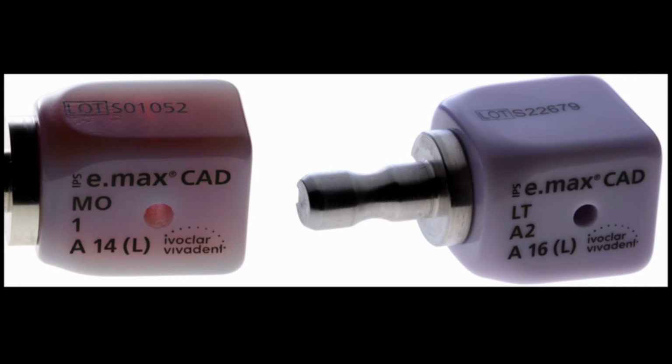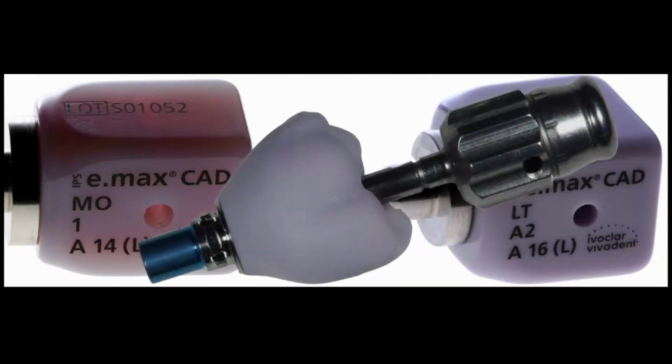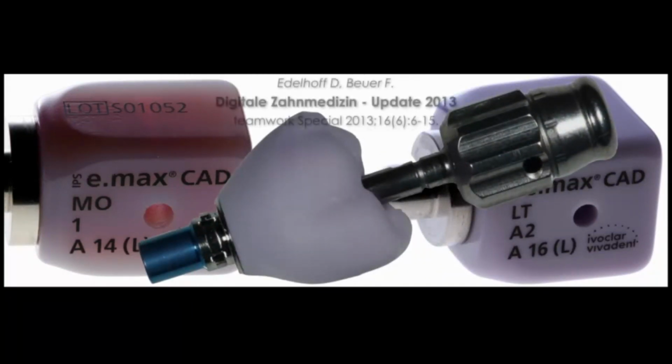If you would ask me now what I would do differently nowadays, the only thing I would change is that I would put another concept on the implant. This is the abutment solution that we already published last year in several patients. We are using this now: it's one piece, abutment and crown, made of E.max CAD.